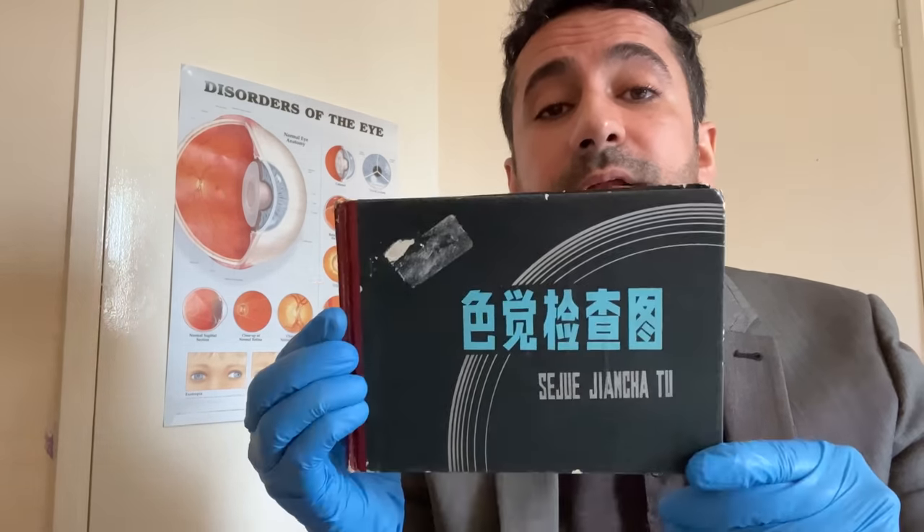Now this test has a mixture of pictures, words, numbers and letters for you to identify. It's quite long so it should be very relaxing for you. That's the front of the booklet, that's the spine and that's the back of the book. So let's get to it with this test — just say what you see, whether it's a picture, word or number. Okay, first plate for you.